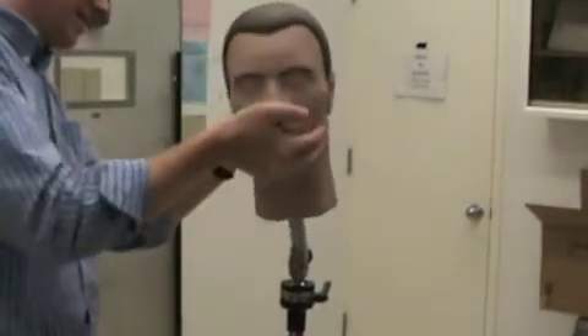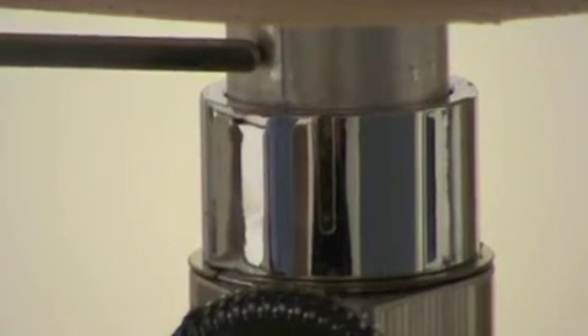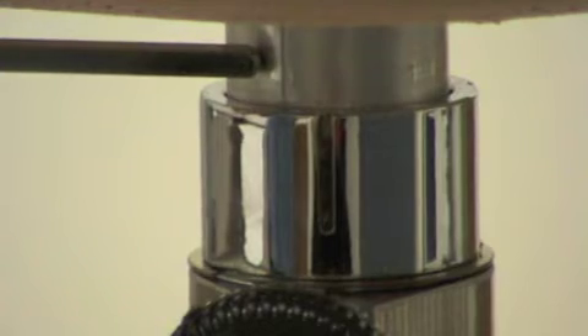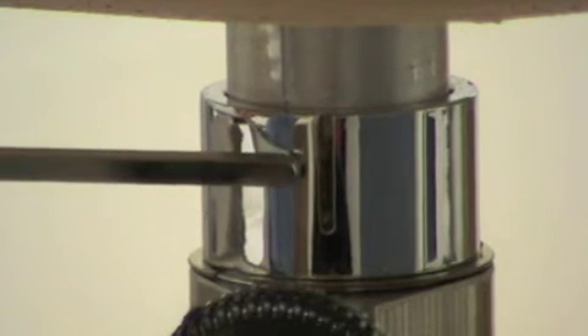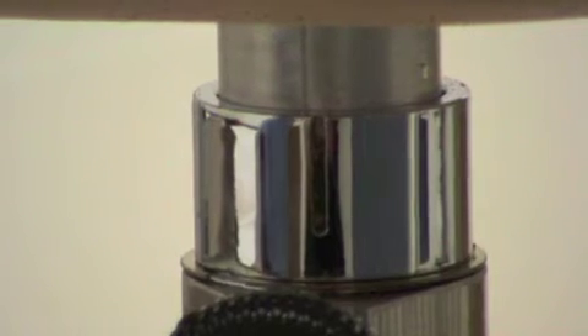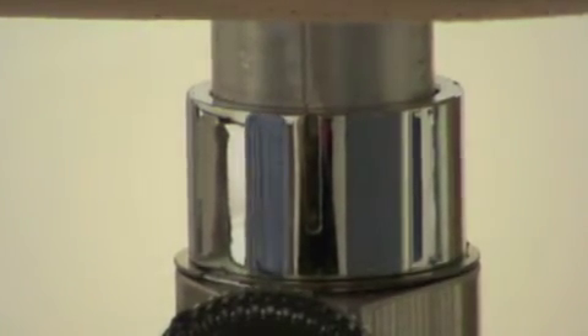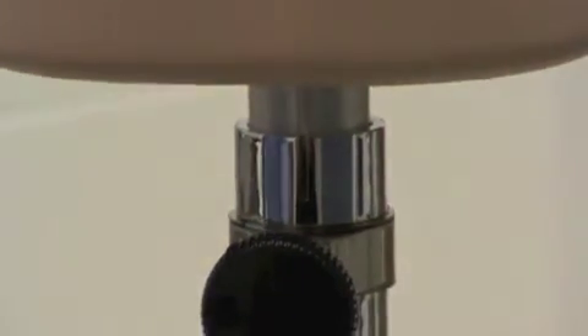Insert Pan-Dexter's neck rod into the top of the stand. Rotate Pan-Dexter's head until the indicator marks on his neck rod match the indicator mark on the stand. Tighten the black knob at the base.